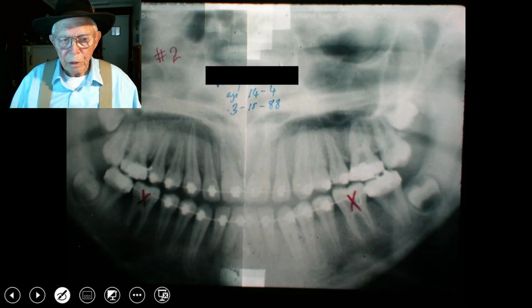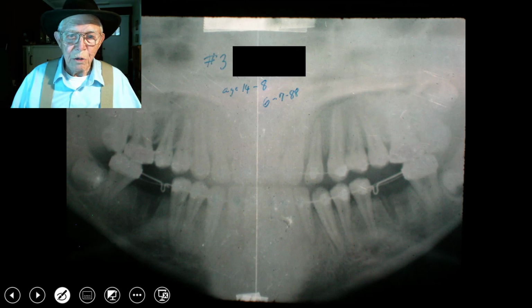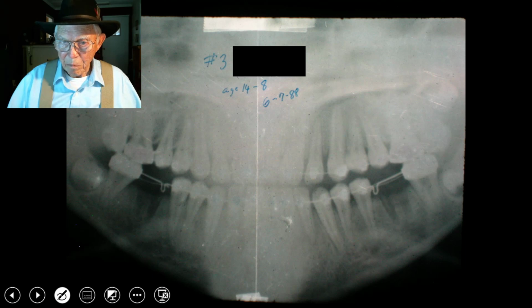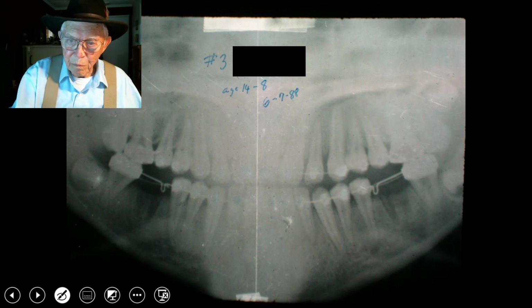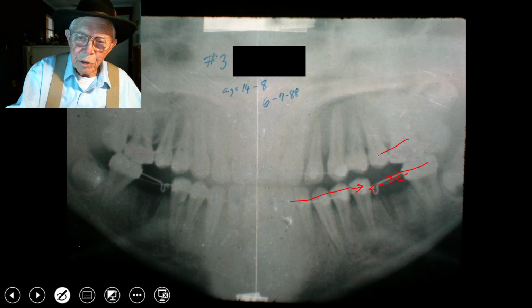Okay, here we come in and we extract those teeth. I didn't do it, somebody did. She was nearly 15 years old when we took those teeth out. And we went that day and started in here, best I remember, and here's the omegas, and we're closing this back into this molar, and we'll be pulling this molar forward as we pull this backward in here, and we'll be pulling this forward.